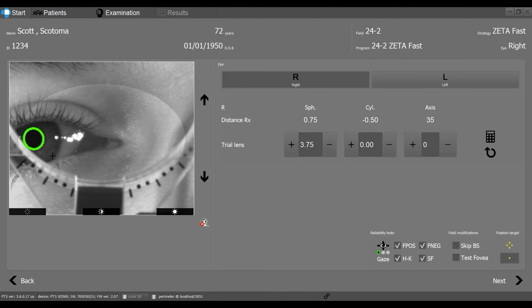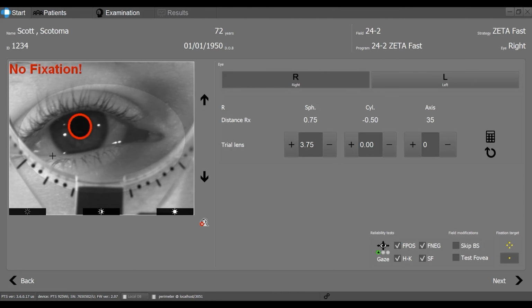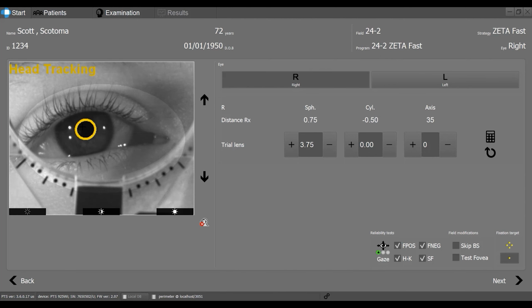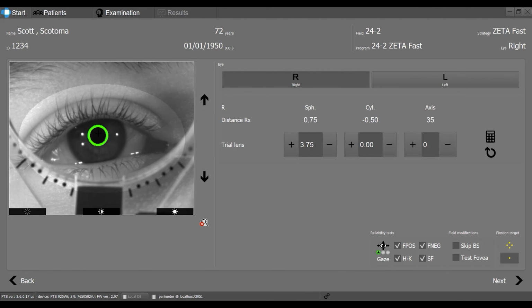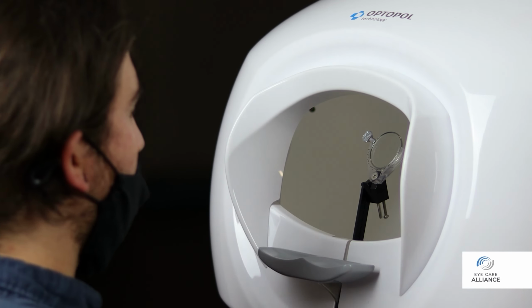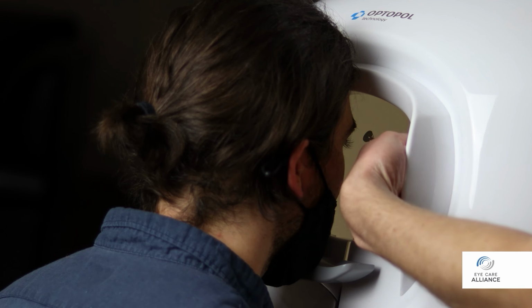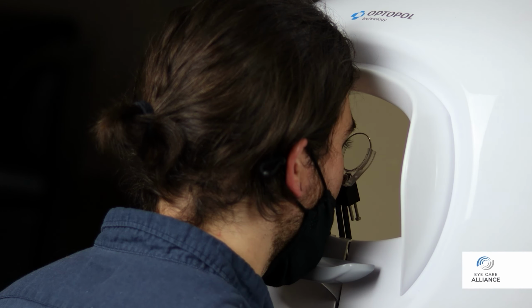The up-down buttons may also be used for fine movement. If the pupil is too far to the right or left, instruct the patient to slide their forehead in the opposite direction of the pupil adjustment needed, using their chin as a pivot. If a trial lens is being used, instruct the patient to place their mask below the nose to avoid fogging the lens. With the patient's head adequately positioned, move the trial lens holder towards the patient, stopping just before the holder makes contact with their face.